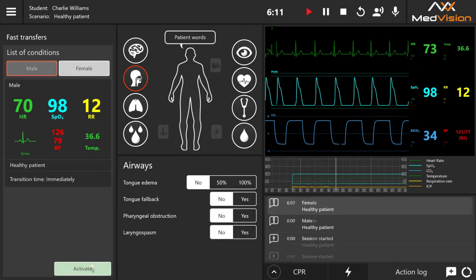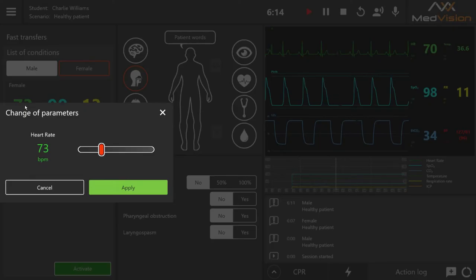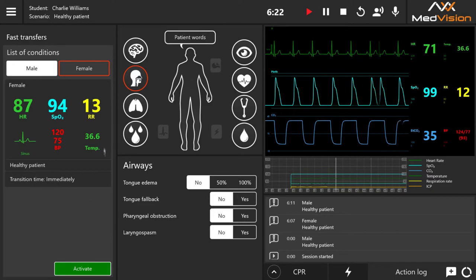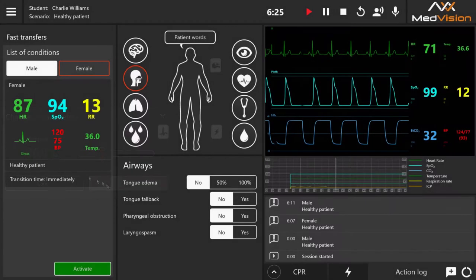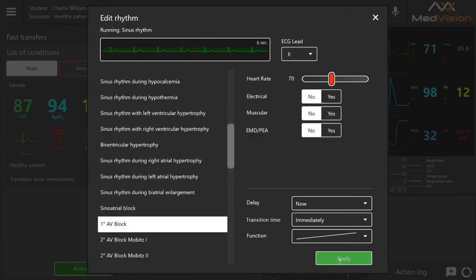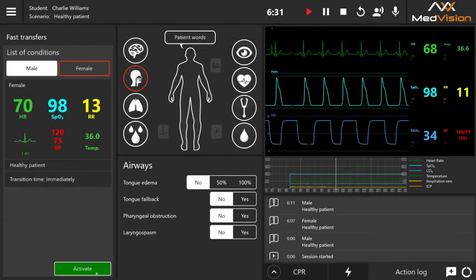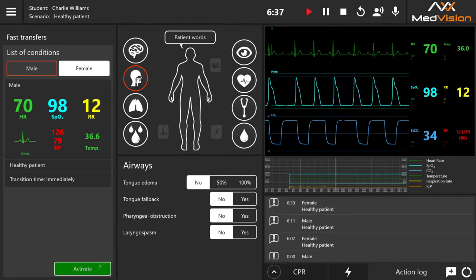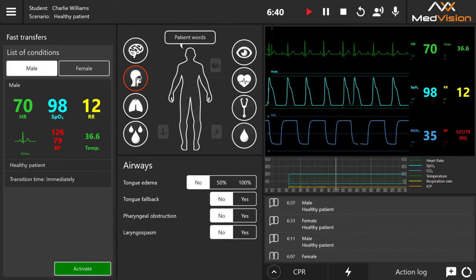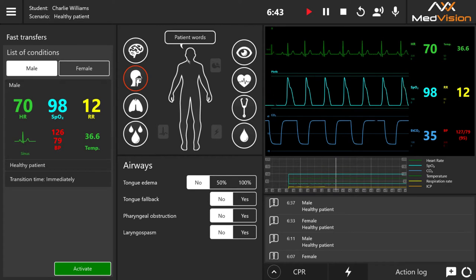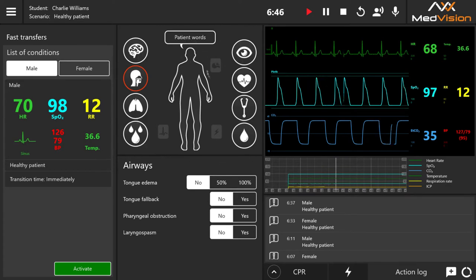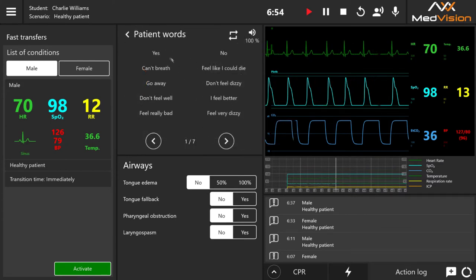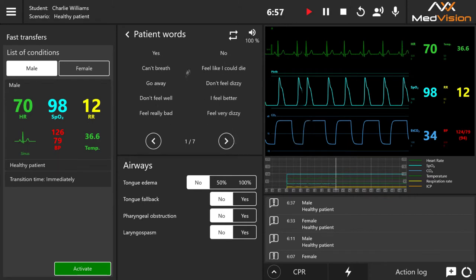Section one is where you choose your condition — for example, switching between a male and female patient. After highlighting the female patient and pressing activate, the parameters change. You can also press on a parameter value to customize it further before switching. The central section contains patient simulator controls. For patient speech, you can choose specific phrases, record and upload your own, set them on repeat, and configure the volume.